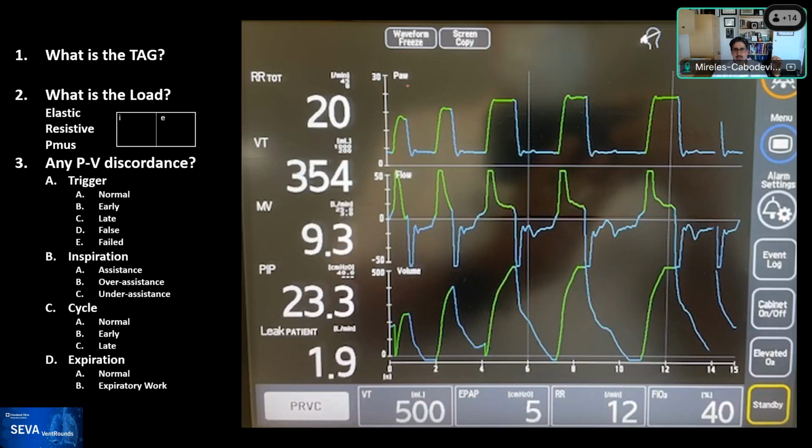And again, just to clarify for all of you that are seeing this for the first time, this type of screen on the ventilator, on the top is pressure, then there's flow, and on the bottom there's volume. And this is actually non-invasive ventilation. All right. So let's look at what the breath control variable is.